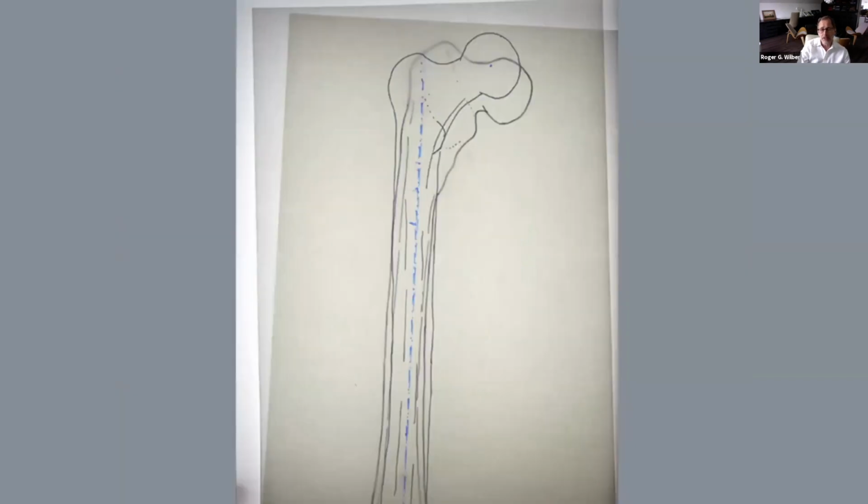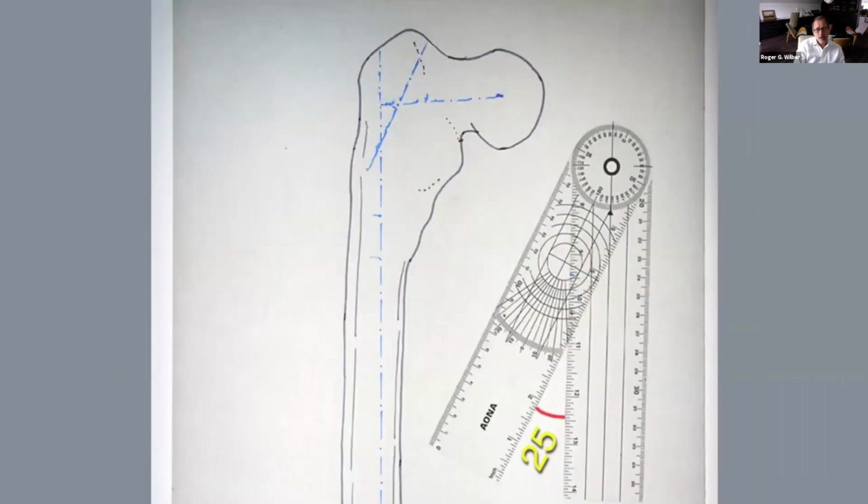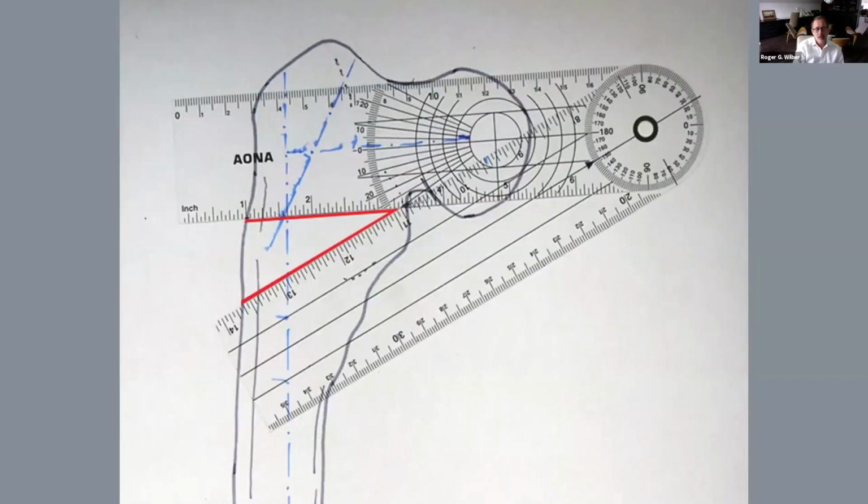And if I overlap the distal parts and look at the proximal, I see what the deformity looks like, and it gives me a little bit of an idea as to where I may want to put my wedge when I want to start to do my correction. Because if you do your wedge someplace else other than where the deformity is, you're going to end up with a secondary compensatory deformity. So again, I know I have 25 degrees, and as Keith mentioned last week, I can play around with this wedge and I can move it to wherever I want. I can take a small wedge out, or I can take a very large wedge out, and I can pretty much put it where I want depending on what the deformity or what the osteotomy demands.